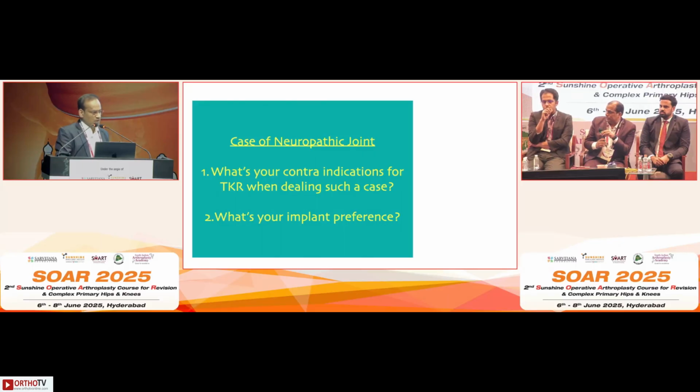Yeah, go ahead. Yeah, perfect. If it's all of this, what implant is your choice? Will you always go for a constraint? I always go for constraint.